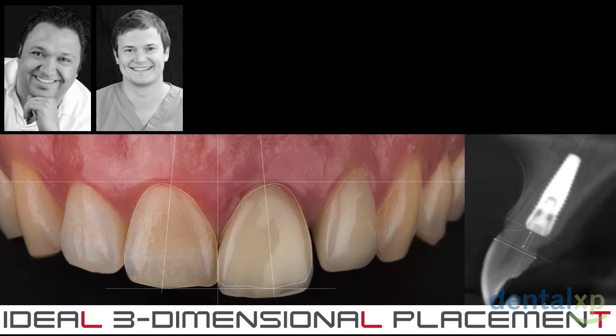Of course, three-dimensional implant placement is not only a critical factor for implant survival, but it also influences the shape of the future restoration as well as the soft and hard tissue contour. Stating that implant position should be prosthetically driven is obvious, but it's not enough.